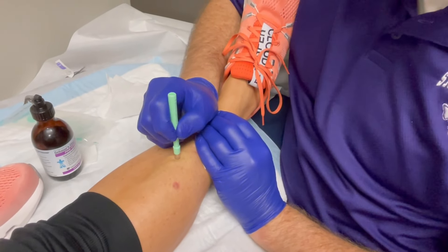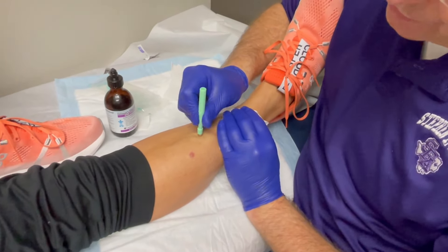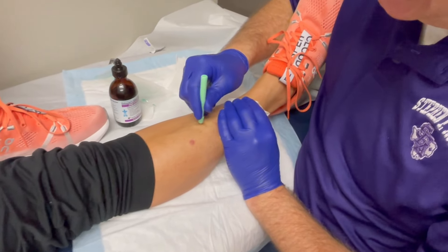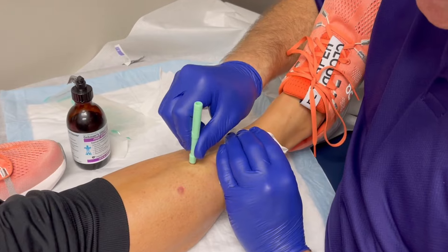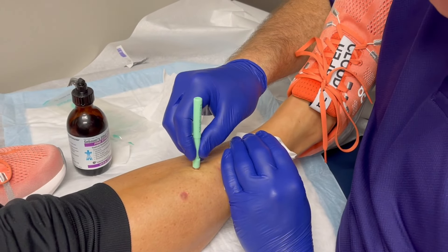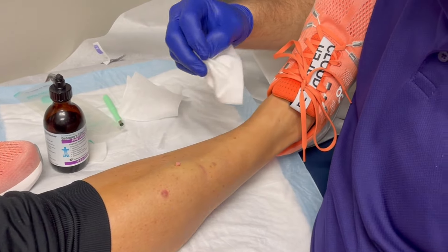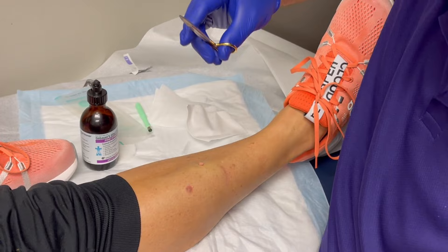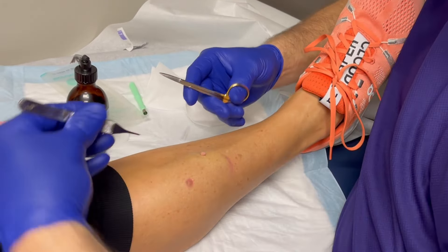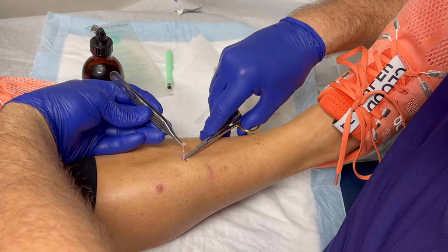We just give it a little twist like that. This is an easy procedure — really anybody who has an office-based practice can do these. This is not something you have to send your patient to a dermatologist for. Forceps — I'm gonna grasp the lesion right there, and then just make a little snip.